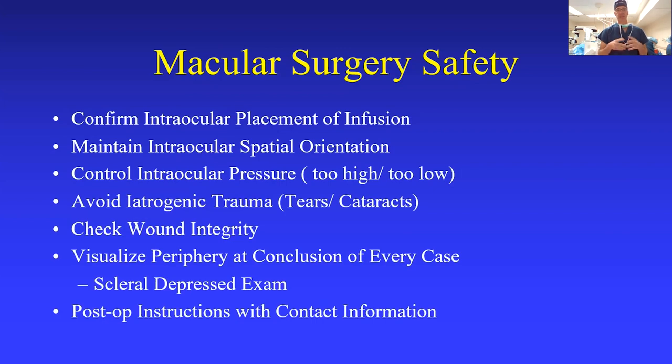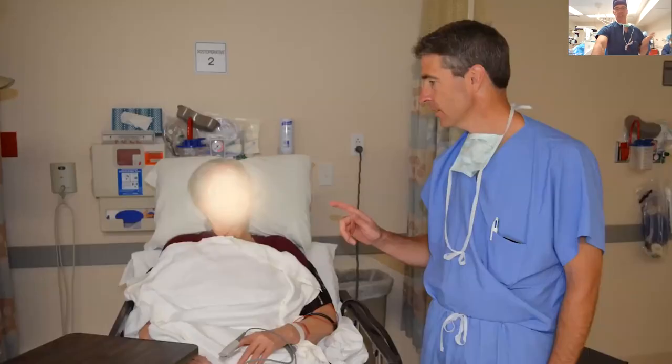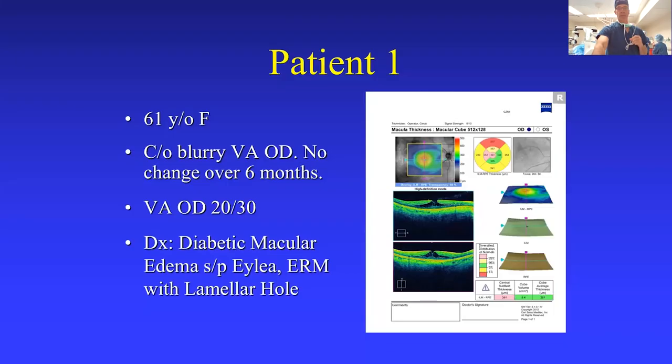So what we're going to do here is start our surgery shortly. We're going to confirm intraocular placement of the infusion, maintain intraocular spatial orientation, control the pressure, avoid trauma, check wound integrity, and of course, post-op instructions. At the end of the case, it's always nice to talk with the patient and go over some of those instructions.